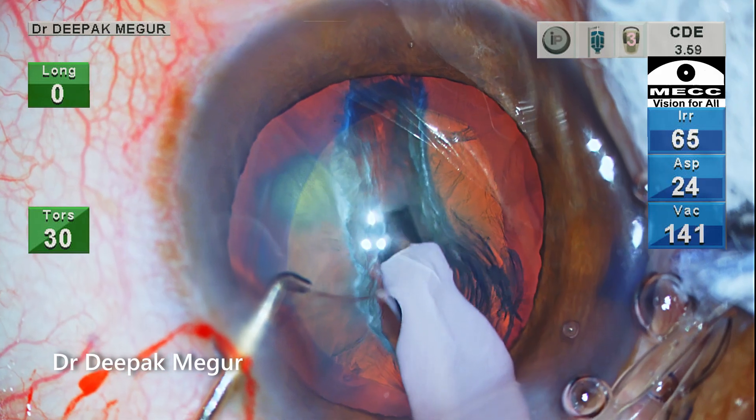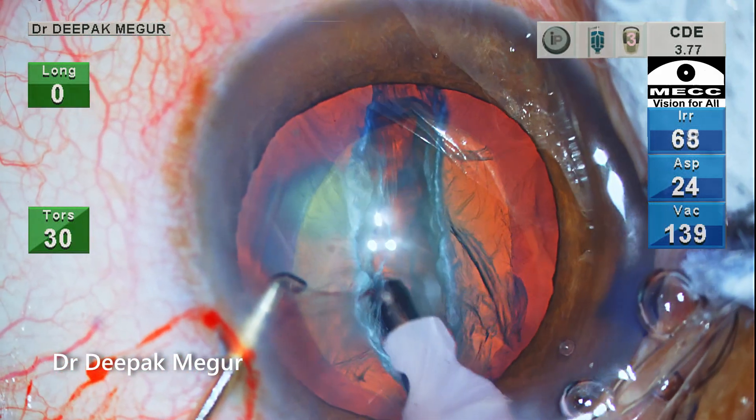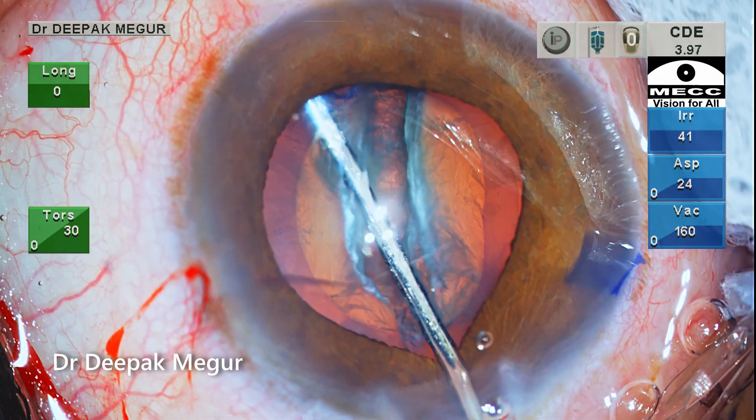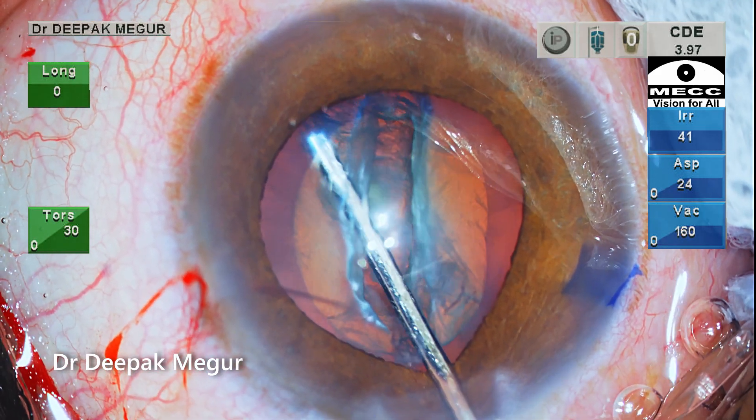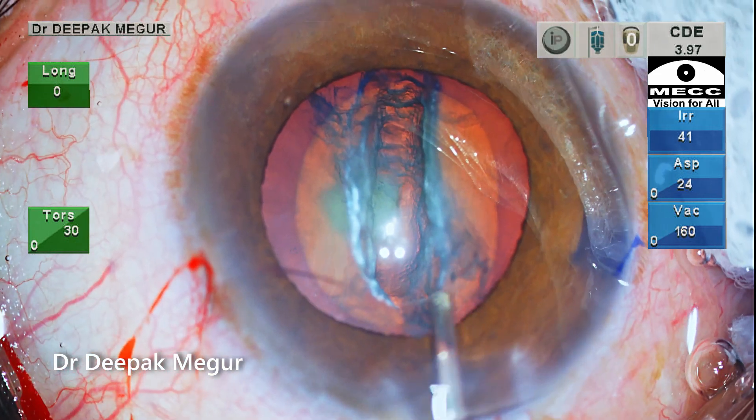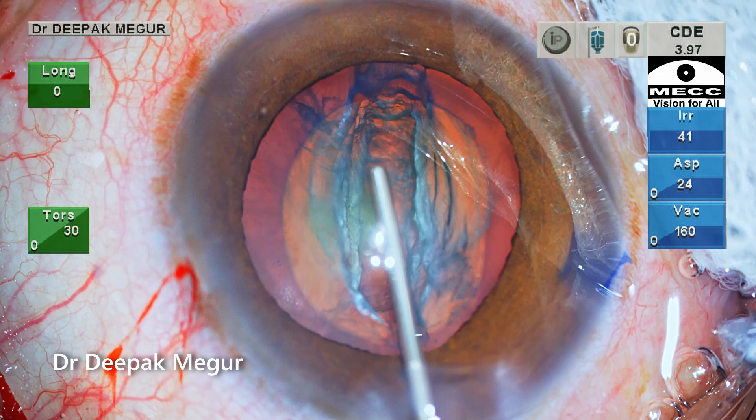A narrow, long trench is created. Inside-out hydro-delineation is performed. I don't see the golden ring, but I don't want to repeat it, as you just want to avoid a rise in intracapsular back pressure.